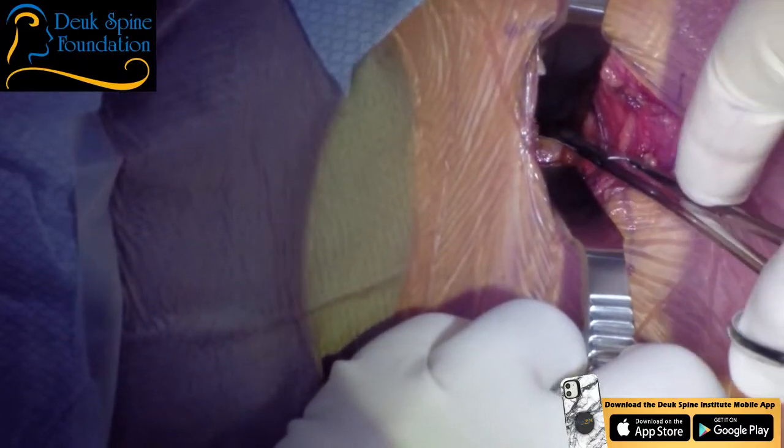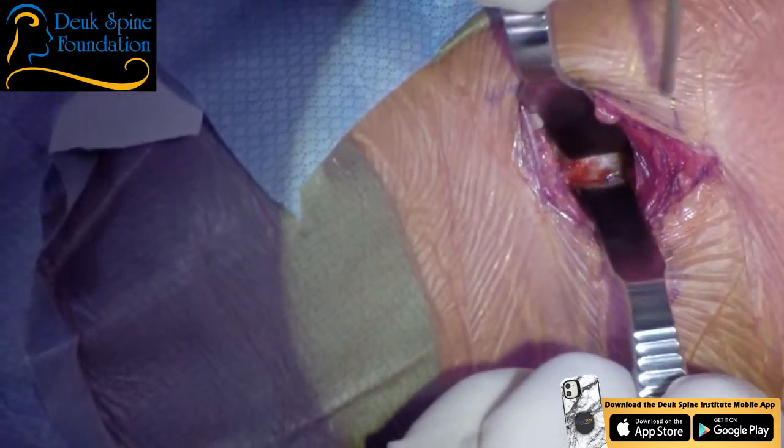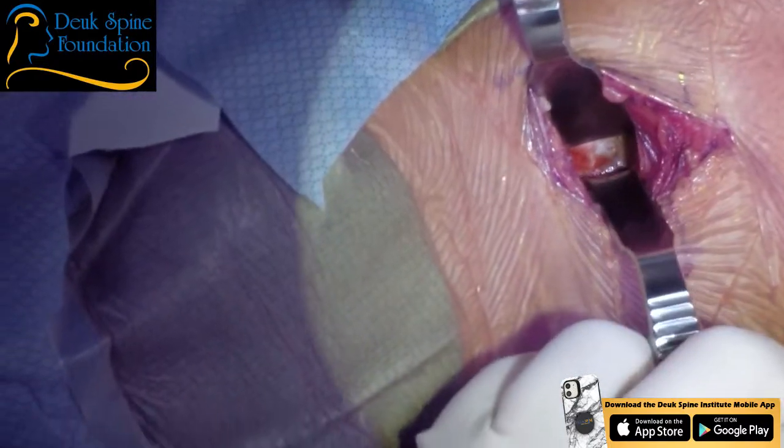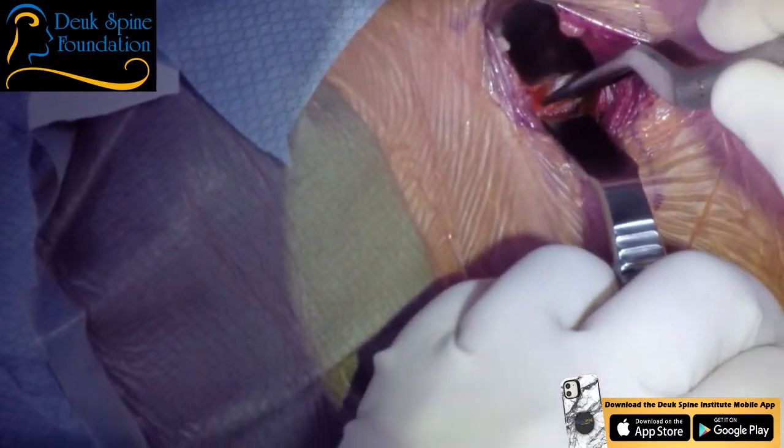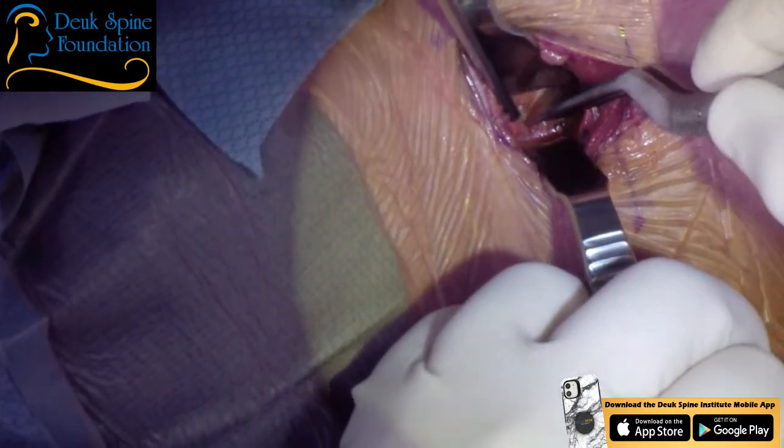So bipolar of it. Now, the blades here, what size do we have? 55, 60. Let me have the bipolar. Yes, sir. Toe in a little bit, move north.